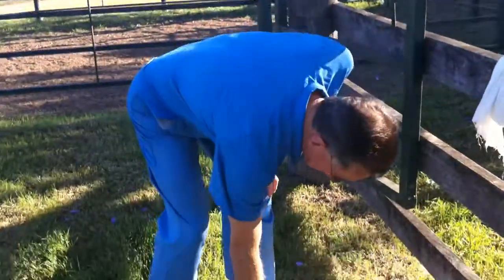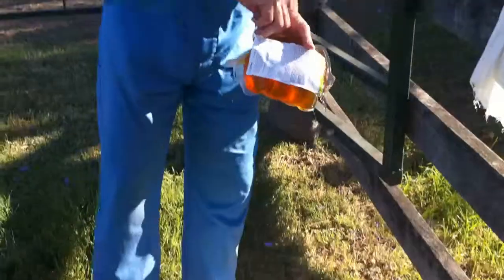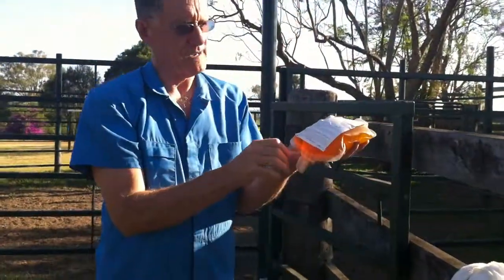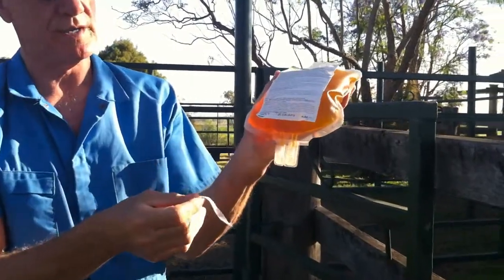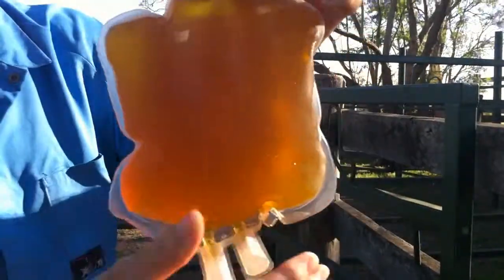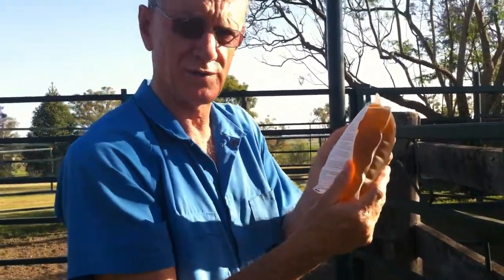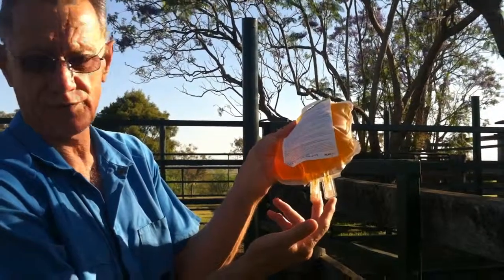The plasma is thawed. I'm going to take it out of the water bath and I'm going to wipe it dry. We then remove the tape that was holding the transfusion ports down. You can see the plasma is nice and clear and fully thawed and it feels at body temperature, which is very important. You don't want to transfuse cold plasma.